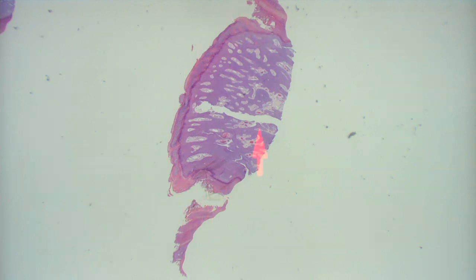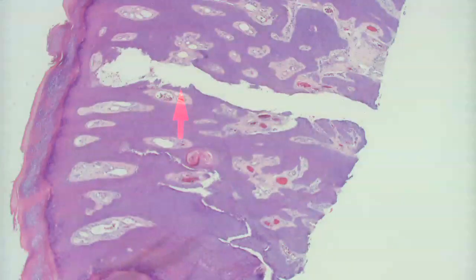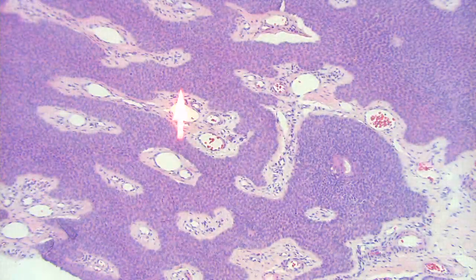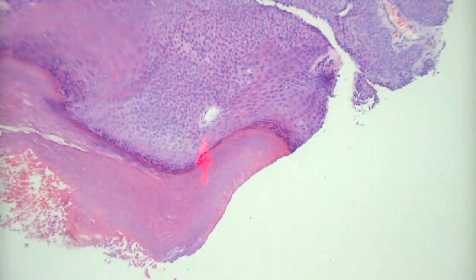Okay, and as we go to higher magnification, so it's epithelial, benign. Now we need to decide what kind of epithelium, right? Any ideas? So there's a lot of uniform blue cells. So it's kind of a hint, I feel like. And then there's also a whole bunch of ducts. Yeah, there's a little duct maybe right there.